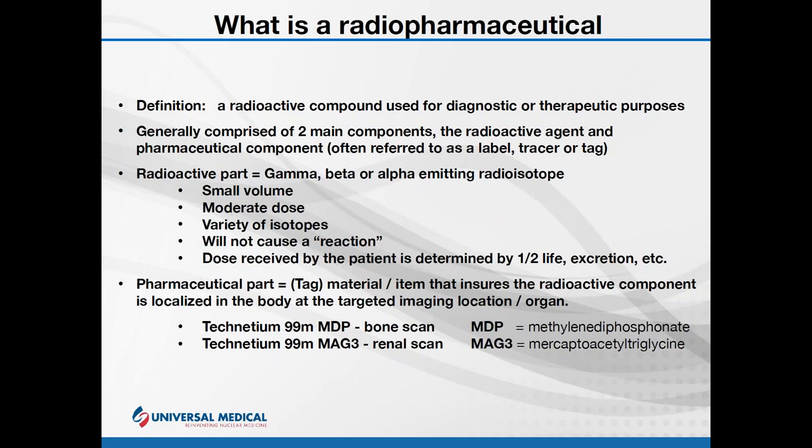The number of studies done, in other words, if I take 2 pictures, or how long the pictures take, all of that is not going to affect the dose at all, because the dose is actually coming from the patient. It's being emitted from the patient. The camera is simply detecting that radiation.